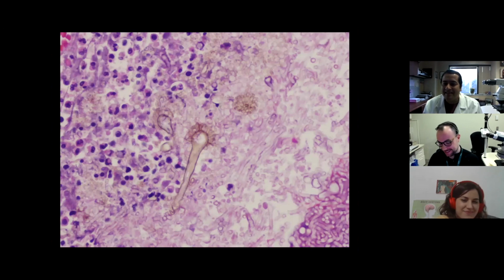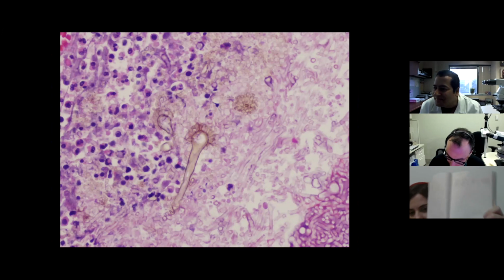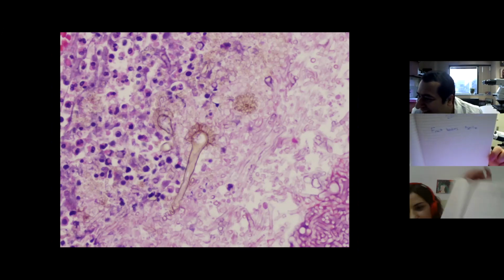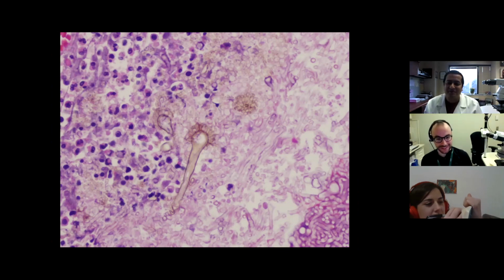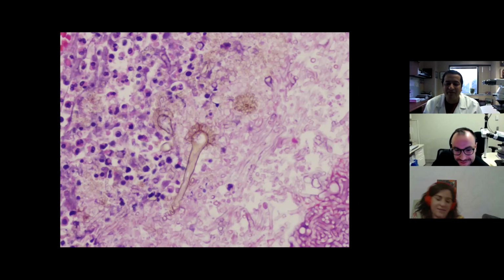This patient has a history of cystic fibrosis with bronchiectasis, and this lesion was seen inside one of the bronchi. I wrote fruiting bodies and aspergillus. Bodies in an aspergilloma. Aspergillus. Perfect. Those are beautiful fruiting bodies, nearly pathognomonic of aspergillus.